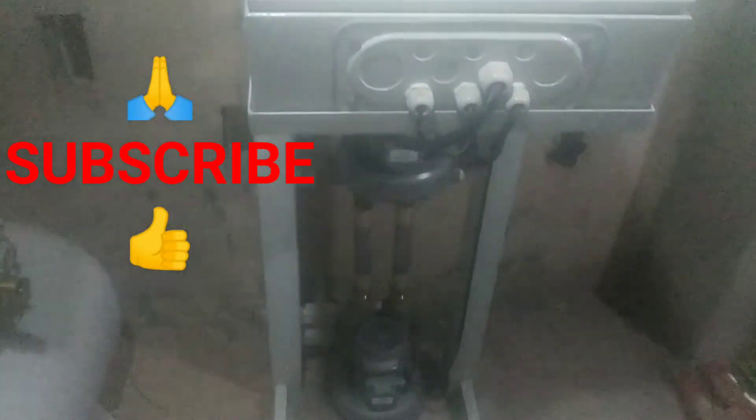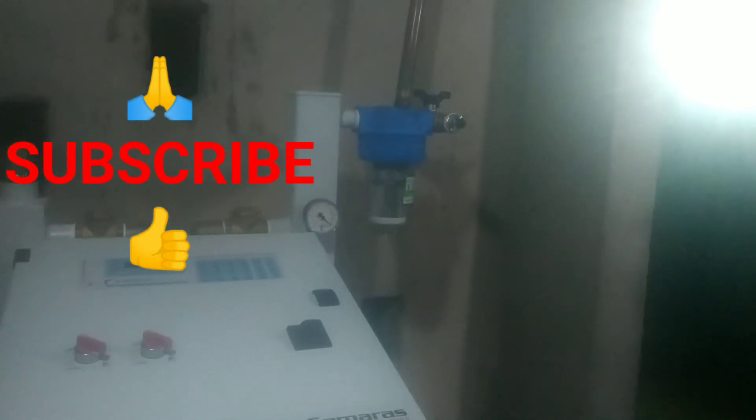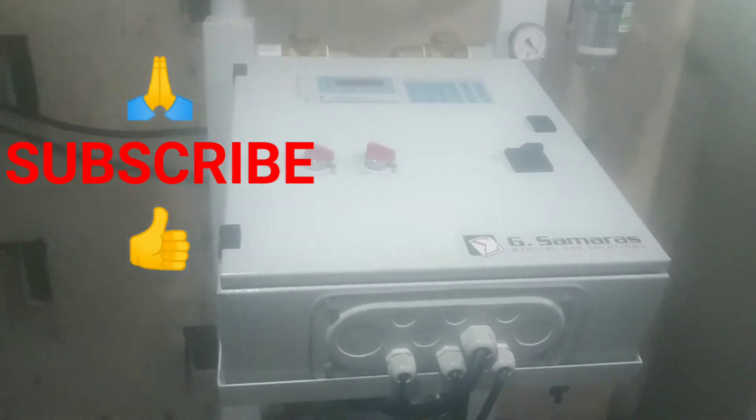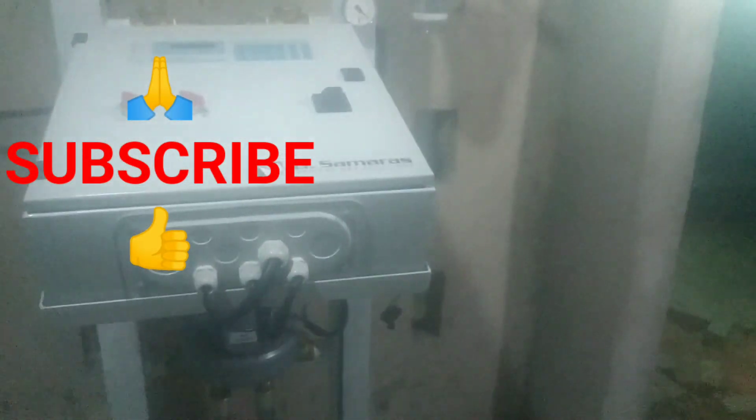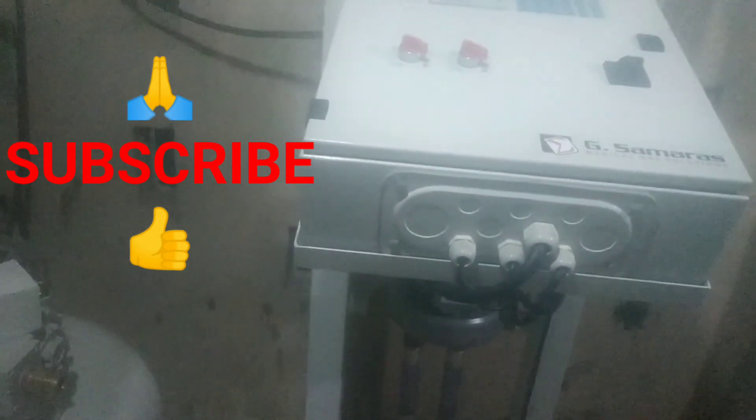It produces oxygen and air. This is the oxygen building where oxygen is being produced and connected to the theater and the ICU.